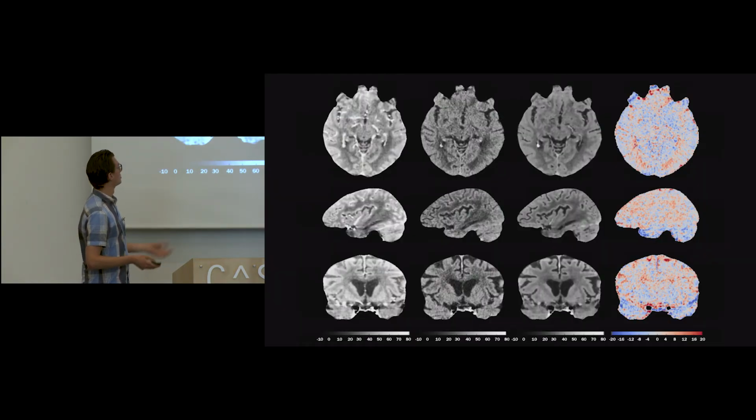Then for some qualitative results, what you see here is the average over time, so T all. So this is actually our baseline. Here we see our reference, which is a non-contrast CT. And this is the reconstructed image. You might think it does not look really like it, but it's actually, I think, a positive case here, because it has learned to filter out a lot of noise. And when you're interested in a signal of interest instead of fooling radiologists, that's actually a pretty good thing.